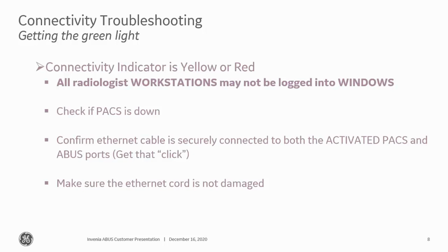What will happen is you will get that yellow triangle in the completed work list screen. So hopefully each day you guys are checking, or after each patient you're checking, to make sure you get the green check mark. And if you don't get that green check mark, you'll get that yellow triangle.